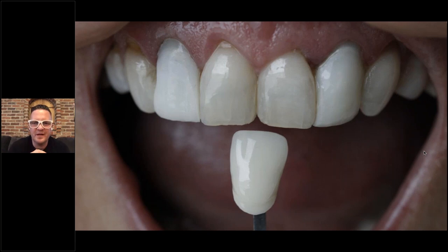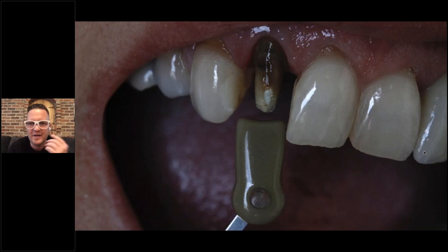She wanted basically the same shape and size as these laterals. So I'm looking at her teeth and thinking, what am I going to do? You want to match these centrals, and I was looking at the colors in there and all the cracks and all this crazy stuff. Then we got to this, where I'm thinking, I don't know what's going to block this out. Maybe some zirconia. But I thought, you know what, let's just see what the blockout power is of the LiSi.